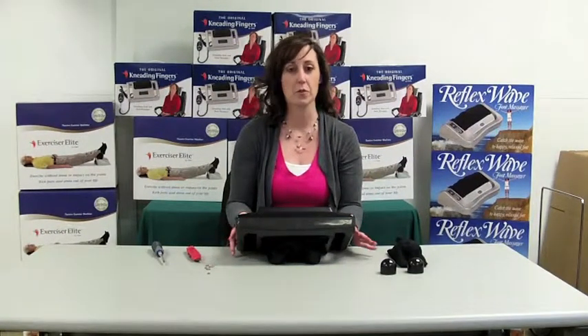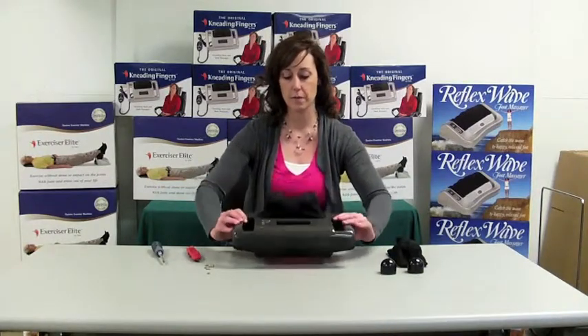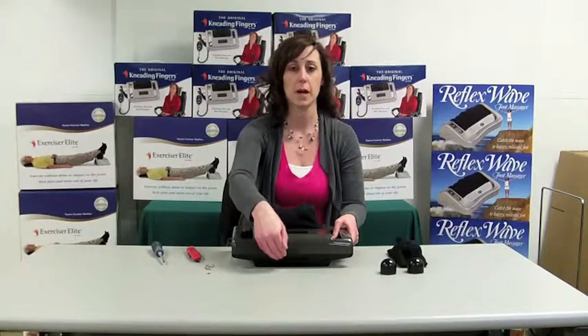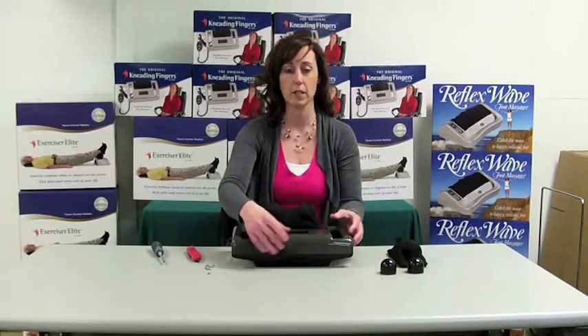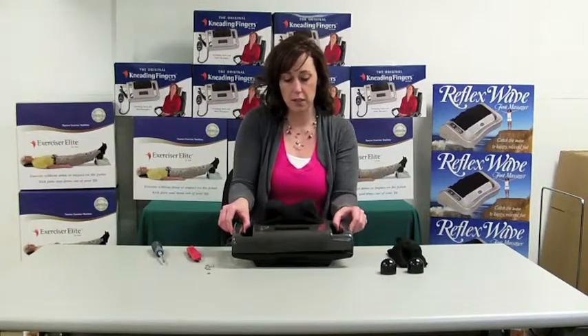Now we have all of our screws out. What you want to do is flip the machine back over right side up. You'll see the top and the bottom case are shaded a little differently. So what you'll do is just take your top case and gently lift it off.